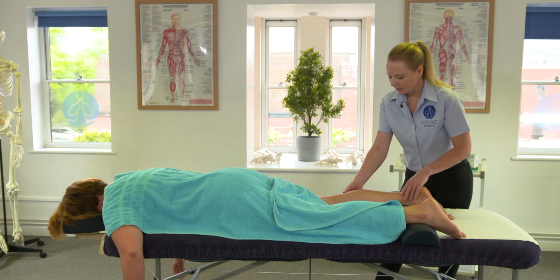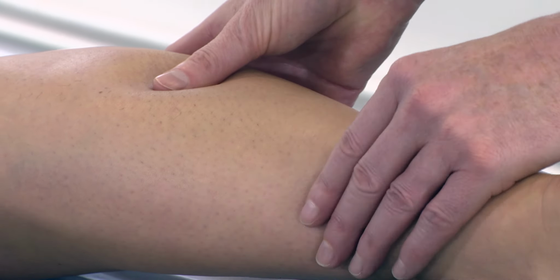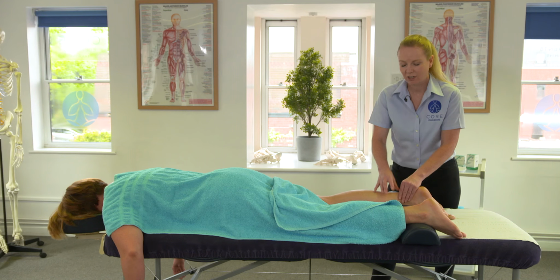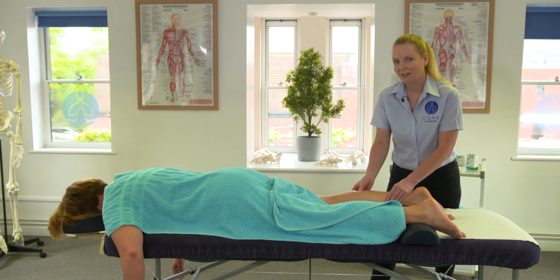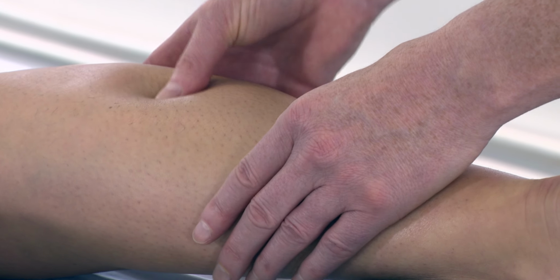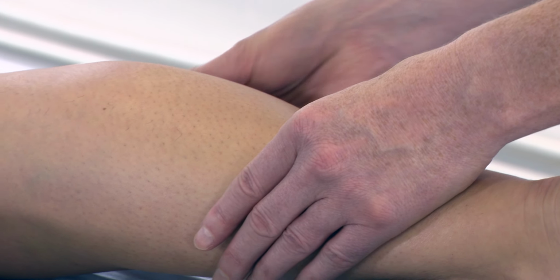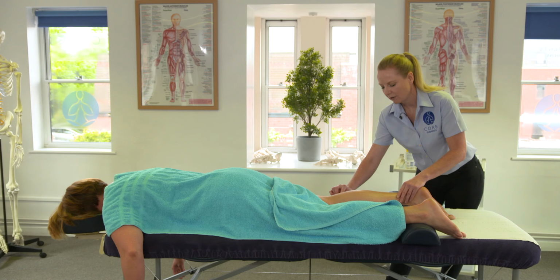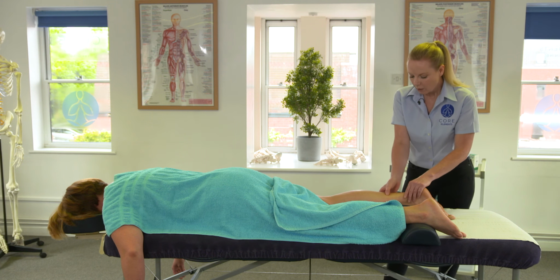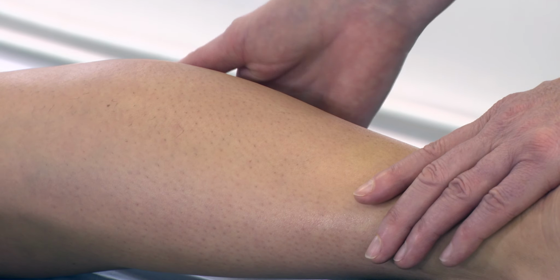Okay, so we're just going to palpate Katie's calf area, her gastrocnemius and her soleus, to feel for that tension, and it's through palpation that we're going to identify where we're going to place those needles. Through palpation, I can identify that Katie's got a nice trigger point just here, and she's also got an area of tension on that lateral head here too. Also, we can feel that Katie's got tension in her soleus just here. So this is where I'm going to place the needles.